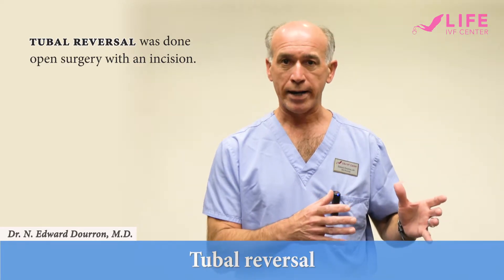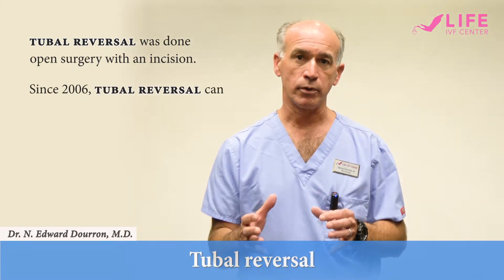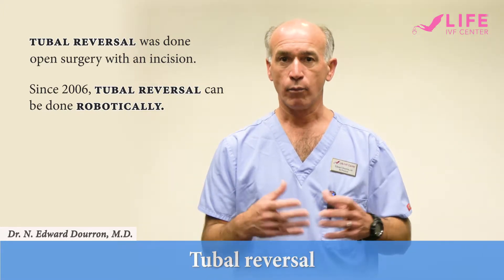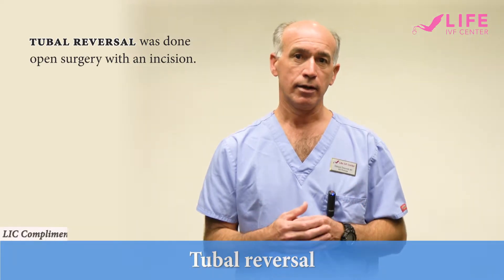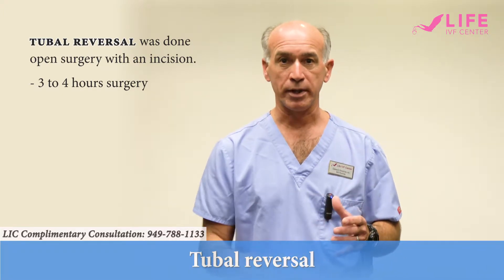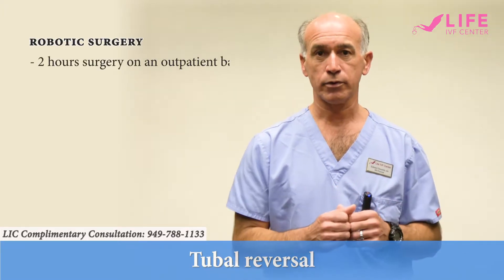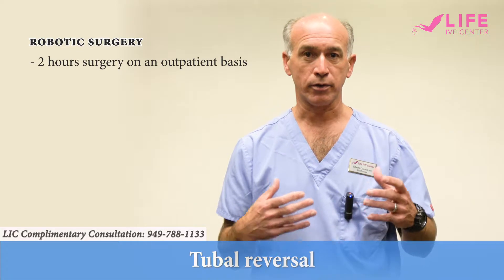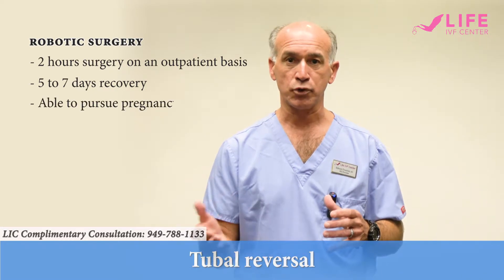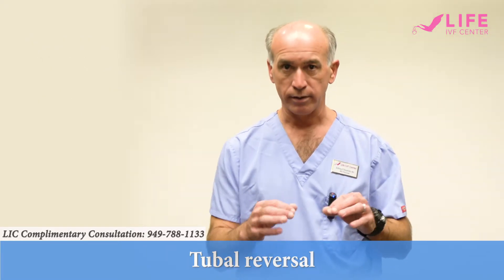With the advent of robotic minimally invasive surgery in gynecology in 2006, we're now able to do even better visualization with more precise surgery robotically. What this means for the patient is that a surgery that may have taken three to four hours in the past with an open incision and a six-week recovery is now performed in two hours on an outpatient basis, where the patient goes home the same day, recovers usually within five to seven days, and can pursue pregnancy with the next menstrual cycle.